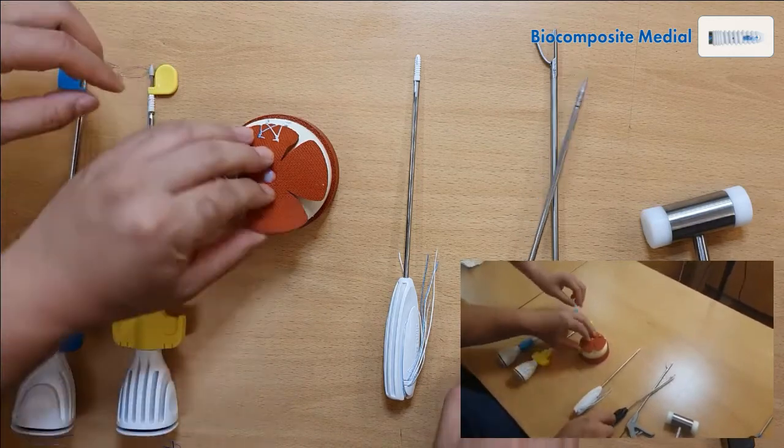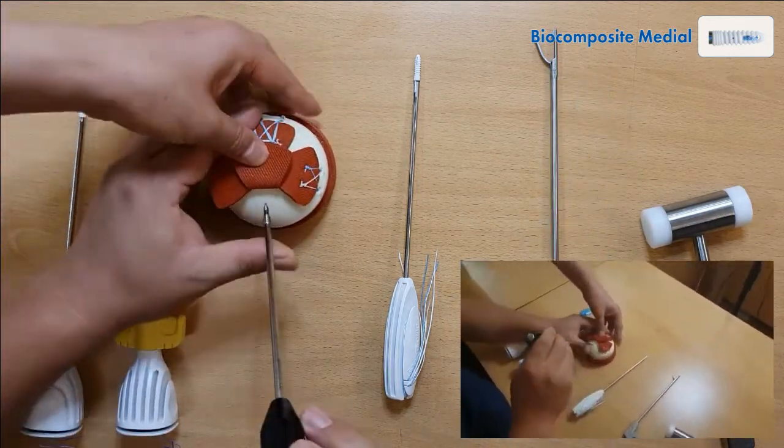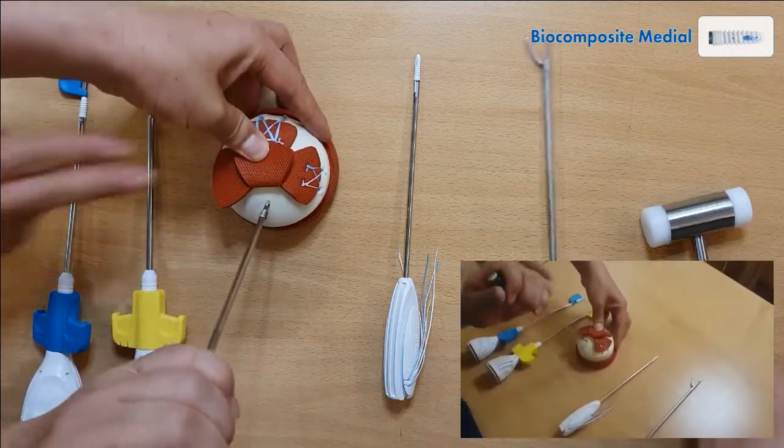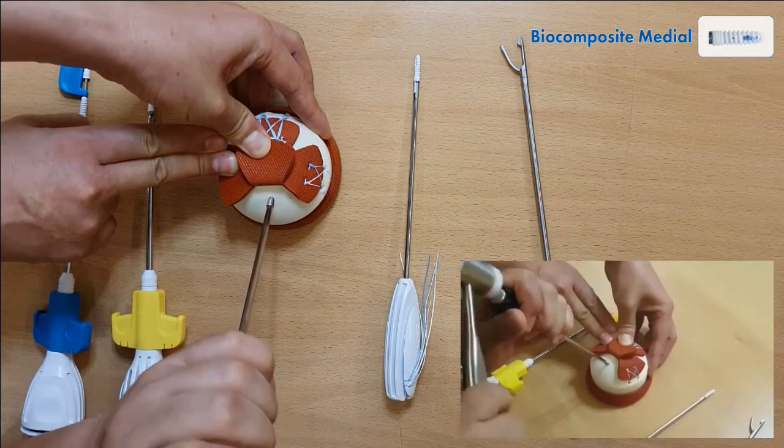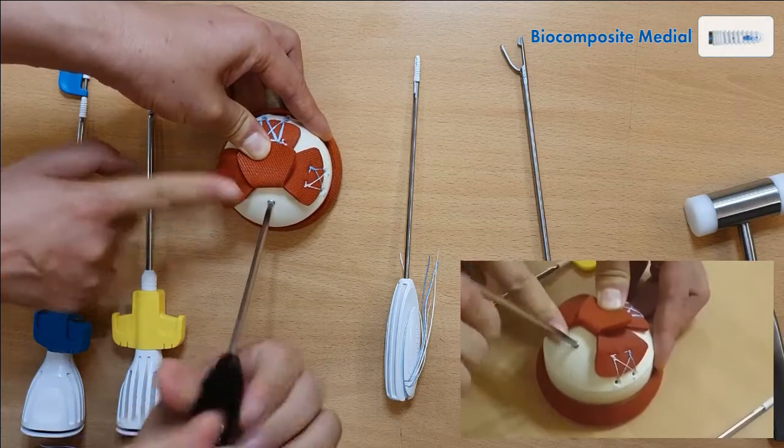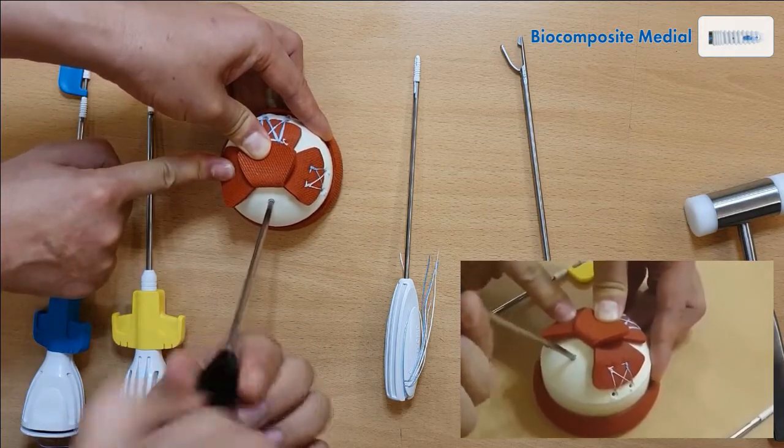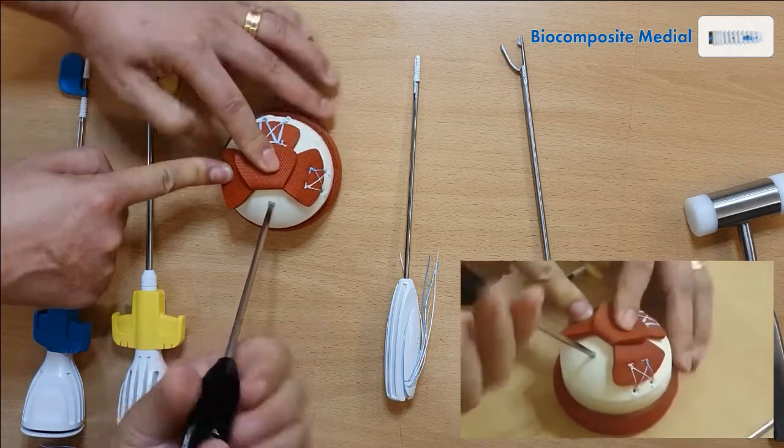I'm going to tap the medial side. Tap it so it could be a little easier to insert the medial anchor.